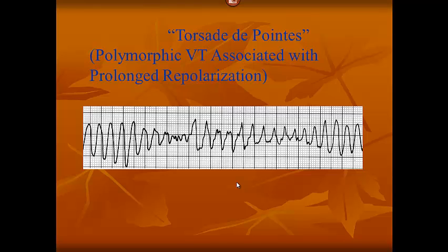This is basically a drastic rotation of the electrical axis with a prolonged QT interval and very short, rapid RR intervals.